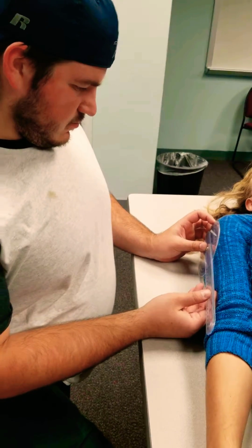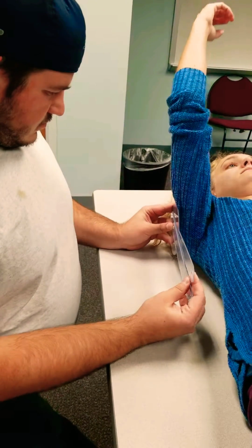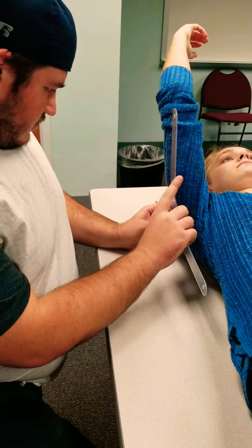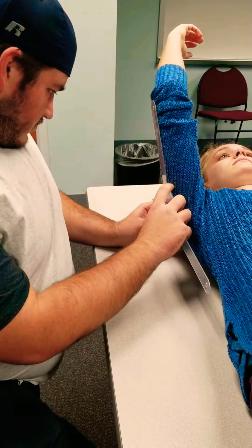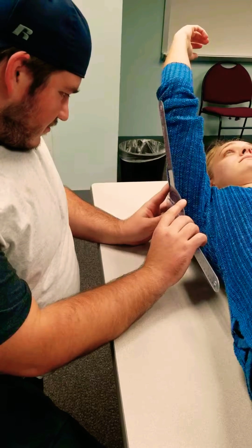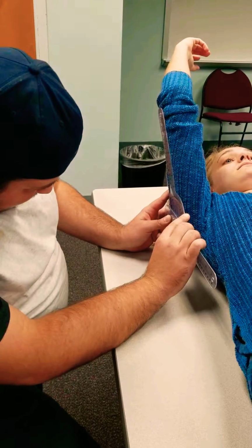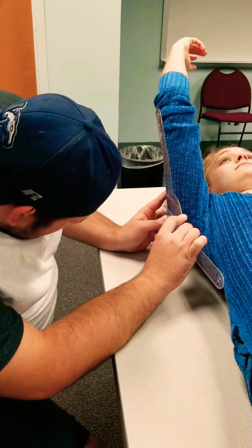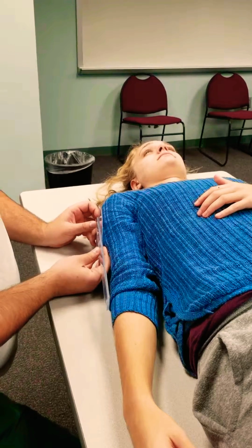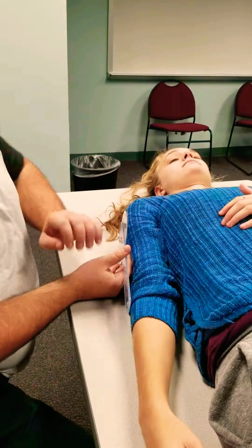The first movement we are going to measure is active range of motion. The next range of motion that we're going to measure is the passive range of motion of flexion.